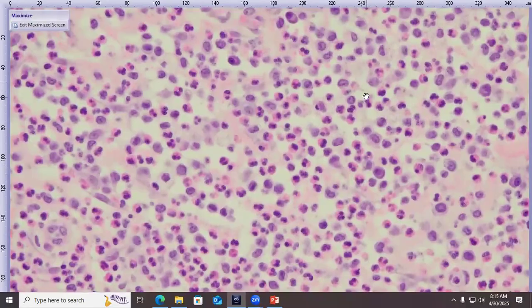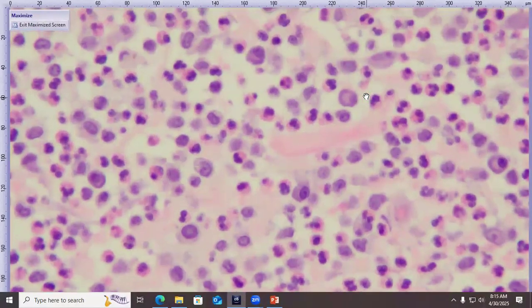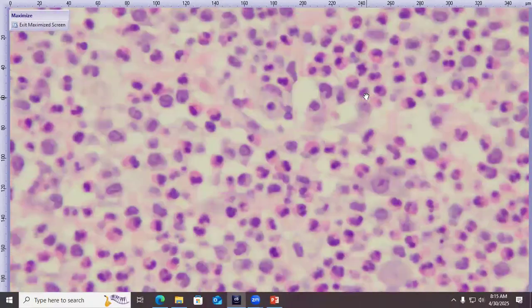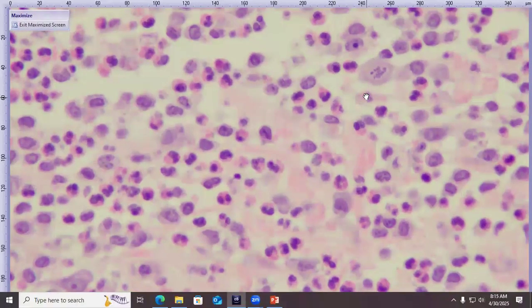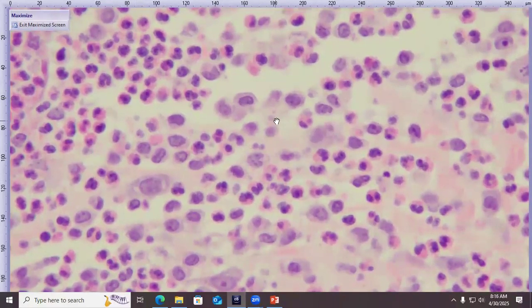Mast cell tumors, we do expect to see cytoplasmic granules. I will say, as of late, I feel like our staining hasn't really highlighted the granules very well, at least in the ones that we've gotten at Coplow. I don't know if anyone else has noticed that. Okay. Yeah. Like maybe this guy has granules, but otherwise the morphology, the eosinophils, is very highly suggestive.